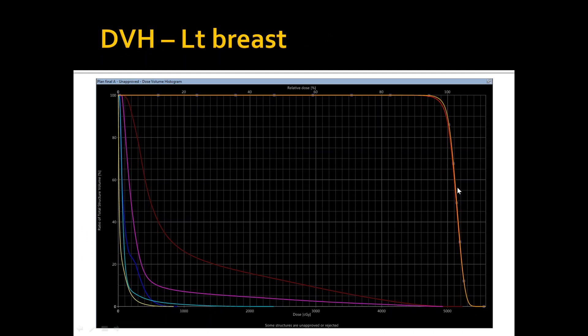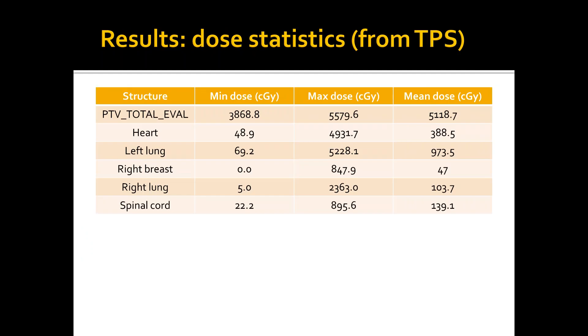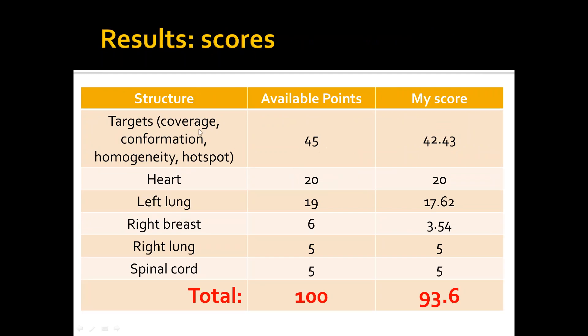These are the dose statistics from the treatment planning system. I just posted it here for your reference. You can find the minimum dose, the maximum dose, and the mean dose per structure. And here are my results. So out of available 45 points for the target, including coverage, conformation, homogeneity, and hotspot, I achieved 42.4. And out of 20 for the heart, I achieved 20. 17.6 out of 19 for the left lung. And the right breast was my toughest organ to spare. I achieved 3.5 only. And right lung and spinal cord, I achieved them, and the total score is 93.6.